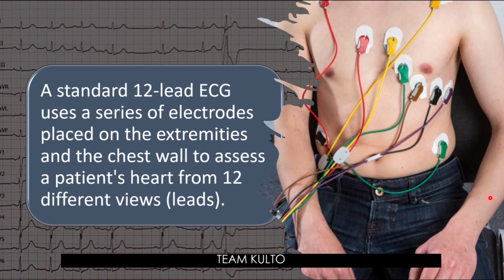Unipolar augmented limb leads, yung iyong AVR, AVL, AVF. And 6 unipolar precordial leads, yung V1 to V6, di ba? The limb leads and augmented leads show the heart from the frontal plane. The precordial leads show the heart from the horizontal plane. Don't worry because sa mga susunod na slides, tatalakayin natin yan in details.